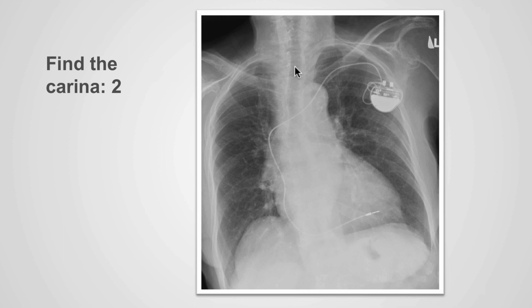In this case, we identify the trachea. We identify the left main stem bronchus. I have difficulties identifying the right main stem bronchus, but knowing that the position is approximately in this area, I can infer where the bronchus is. Or I can follow the inferior border of the left main stem bronchus to the midline, and this gives me the approximate position of the carina.